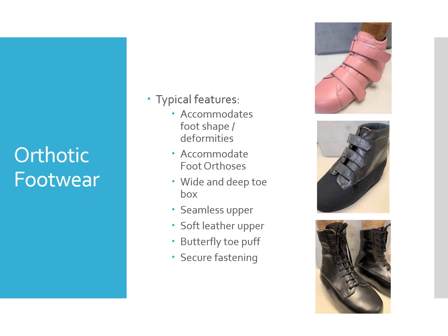Material choice and spec is very important and individual patient considerations must be taken into account when prescribing footwear, whether this be a specific lining that's more durable or maybe a waterproof lining, or whether a harder lightweight sole is required depending on the patient needs. We must fully delve into the patient's history and requirements before prescribing footwear.